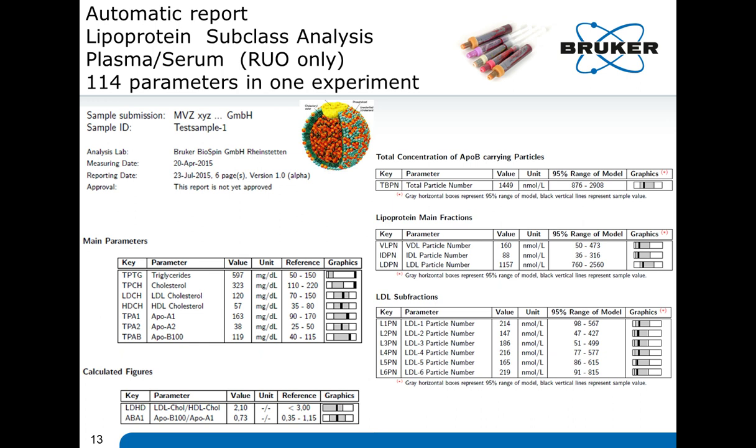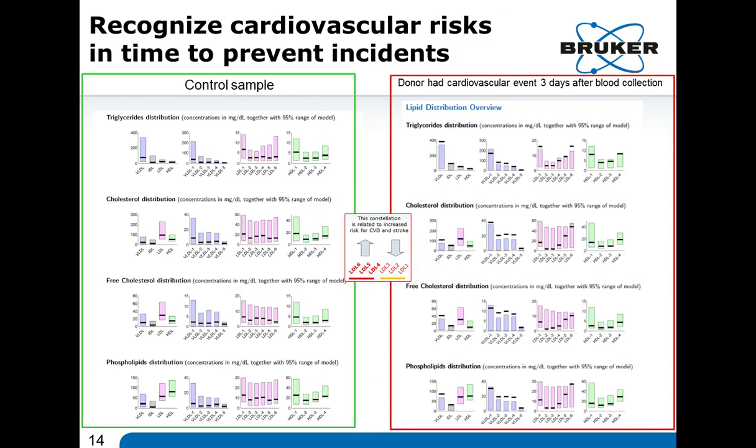So how does that look? What you see here now is a report, again, that looks quite similar to the small molecule report you have seen. We have these gray bars determining the normal ranges in our model, and then you have the actual person, which is identified with the black bar. And as I mentioned before, there are main parameters. These are the overall triglyceride and cholesterol, and then we go into the main classes: LDL cholesterol, HDL cholesterol, ApoA1, ApoA2, and ApoB. We have particle numbers, I will not go into detail on all of that.